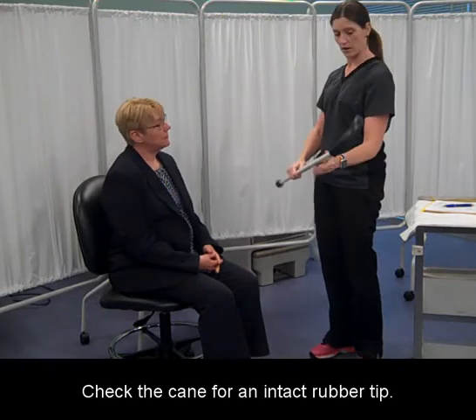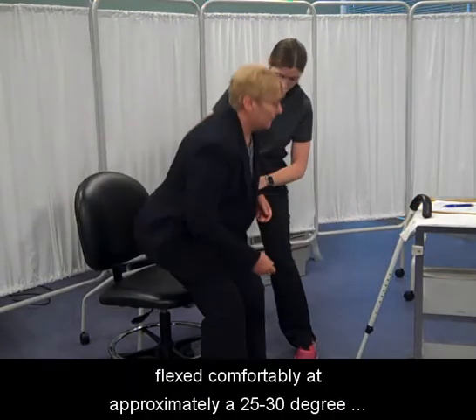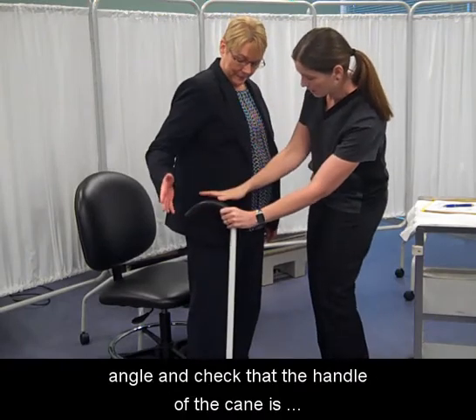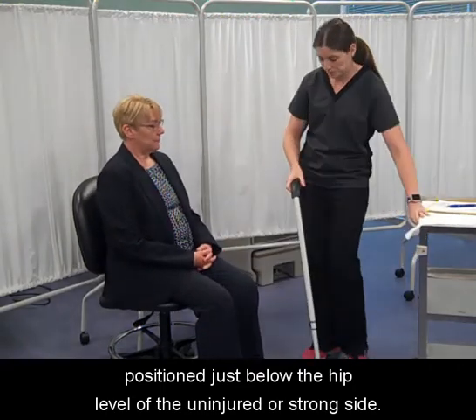Check the cane for an intact rubber tip. Adjust the height of the cane so that the patient's elbow is flexed comfortably at approximately a 25 to 30 degree angle, and check that the handle of the cane is positioned just below the hip level of the uninjured or strong side.